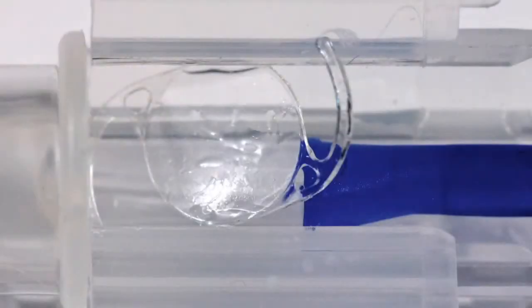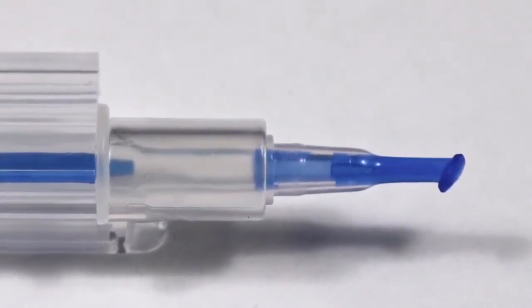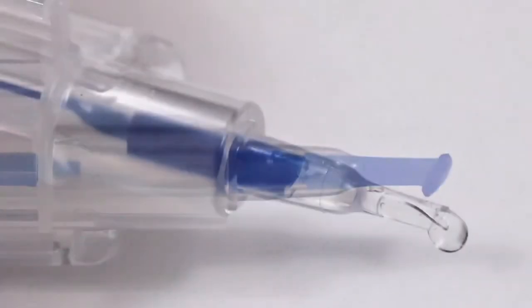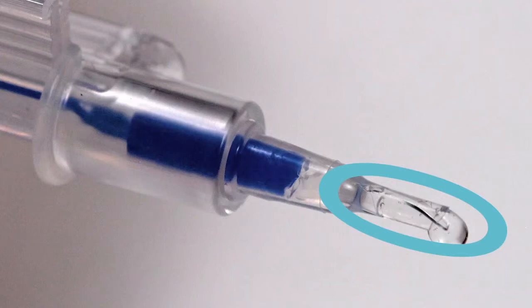If the lens pops up during plunger advancement, reposition the lens and ensure that the optic and both haptics are properly seated under the grooves. Avoid extending the plunger tip past the cartridge tip in order to prevent mushrooming. If you notice that the leading haptic is straight as the lens is advancing in the tip, then the lens is not correctly positioned.